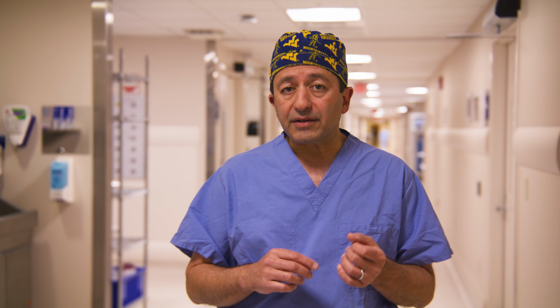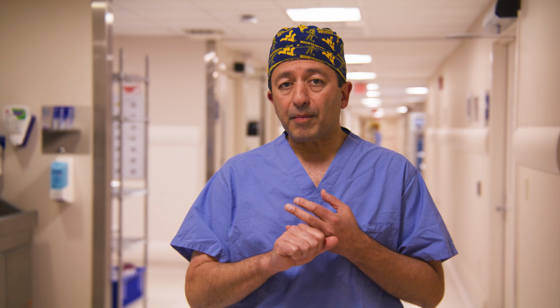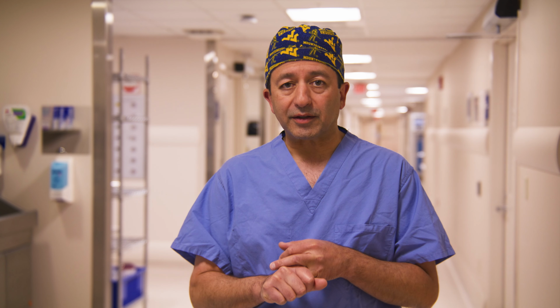Traditionally, that's done through an open sternotomy, but it is actually ideally suited in an isolated format to be performed robotically. So let's have a look at mechanical valve replacement and tissue valve, mitral valve replacement performed robotically.